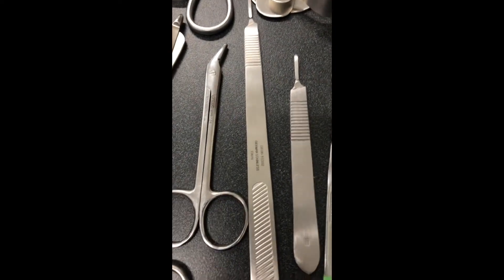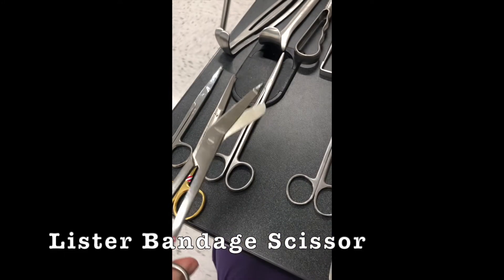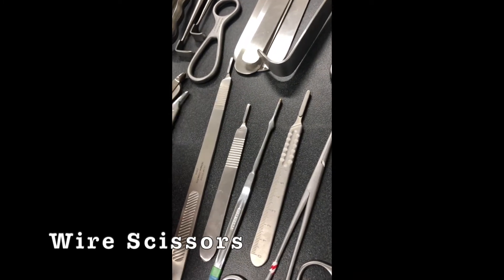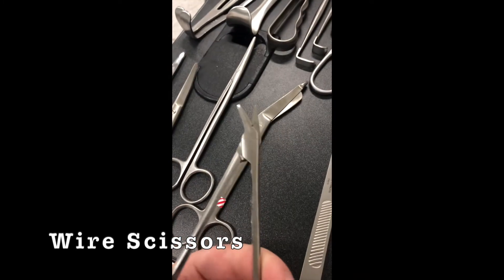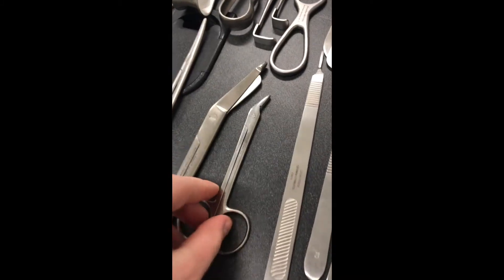And then we've got the Lister bandage scissor, and then you've got a wire cutter. What's the official name for that? Wire cutter. And it's got a little hole.